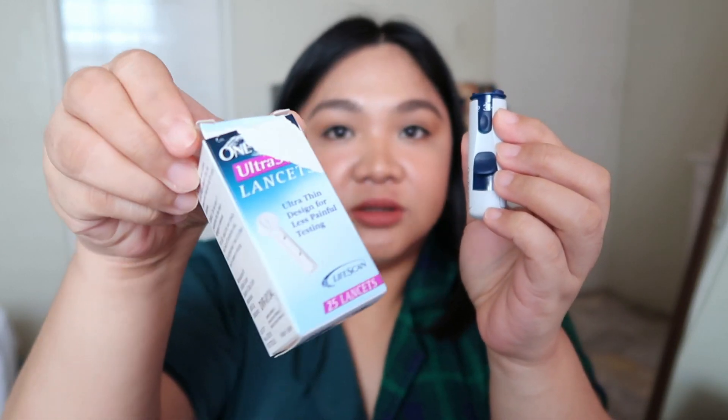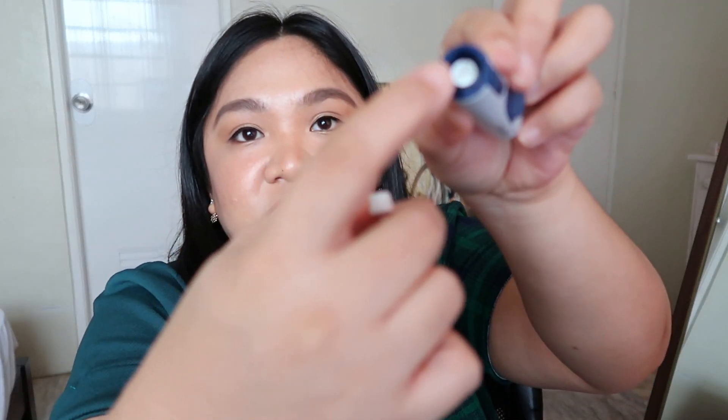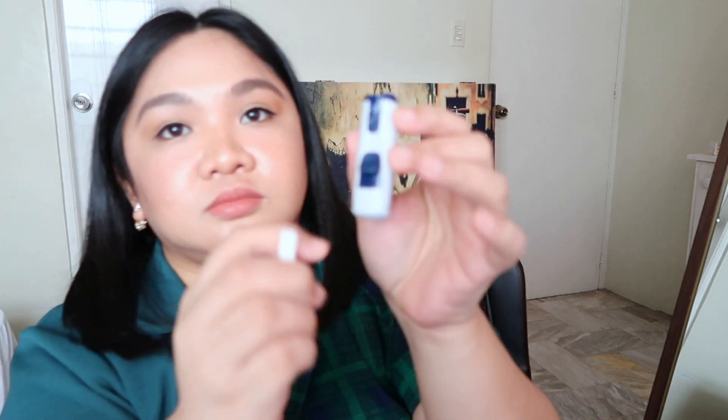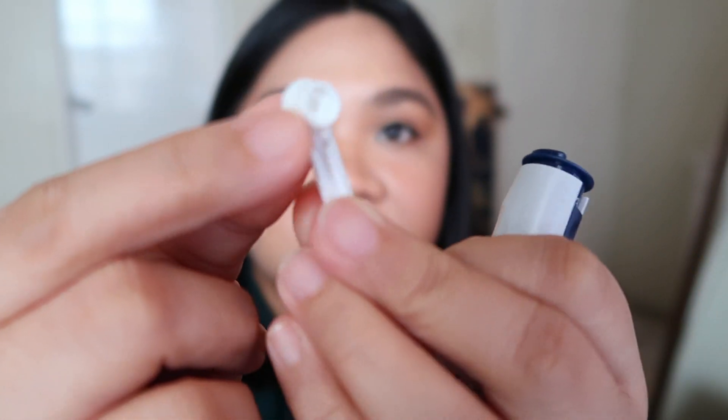Once you're done, we will start assembling the lancet or the lancing device first. Remove the cap, then get one lancet from the box and simply push it inside. The white part is where you place the lancet. Don't remove the cover — the circle — just put it in downwards.